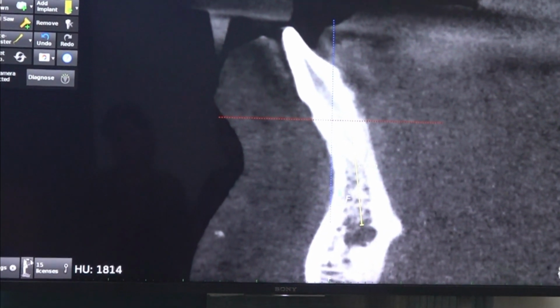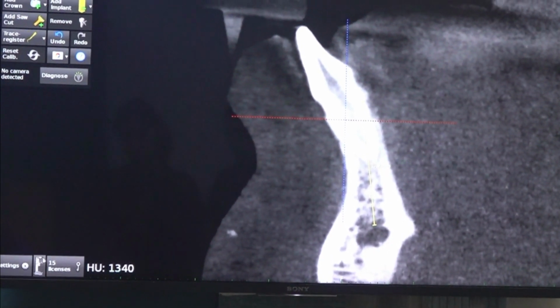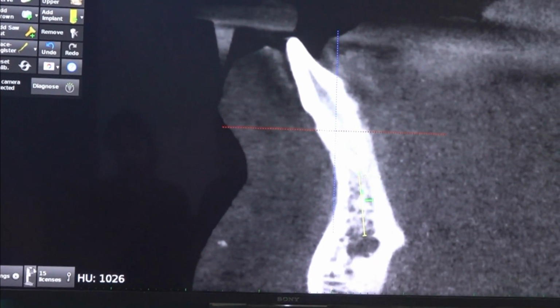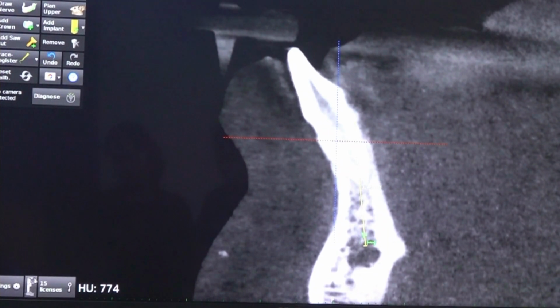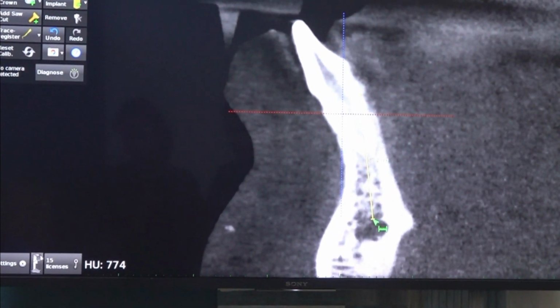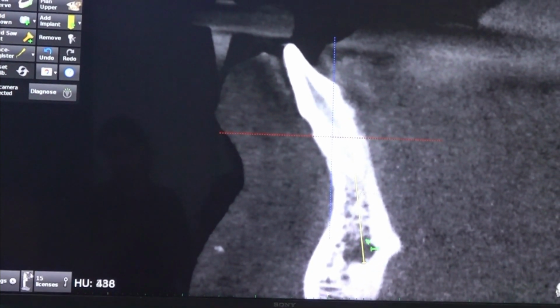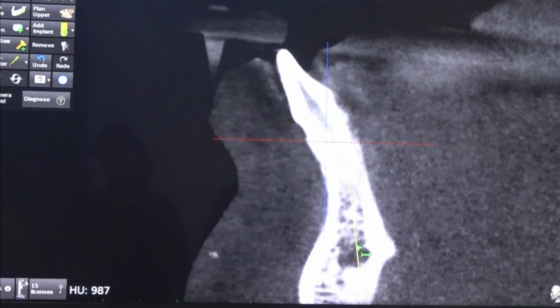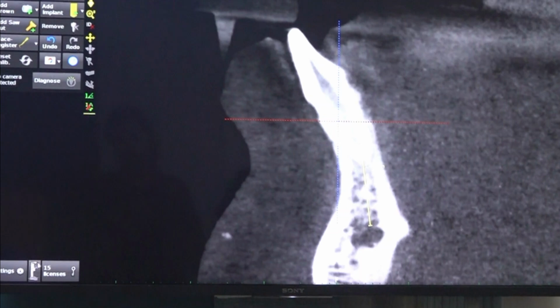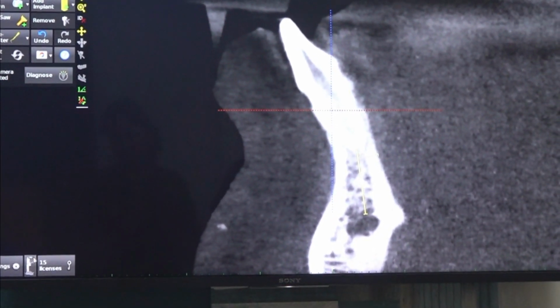In case you want to catch some good cortical bone, only then should you select a longer implant. But here, whether you put 14 or 17, it will be within this good bone. Actually, selecting a longer implant may compromise the stability. If 3 threads are in this cancellous bone, only 2 threads will be in good bone. So selecting a 20 is not a good idea. 14 or 17 will be enough most of the time.